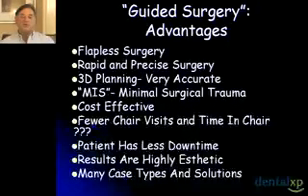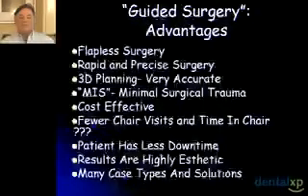There's some work at Loma Linda doing brilliant work on partially edentulous cases, in particular in the aesthetic zone, and there are about 4 papers coming out from their group in the near future, and you'll see the applications of this. Originally, it came out for totally edentulous cases, which are very, very predictable. With partially edentulous cases, knowing how to position the implants in 3 dimensions is quite nice.